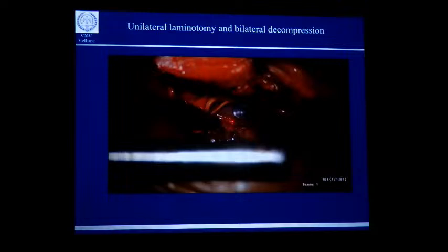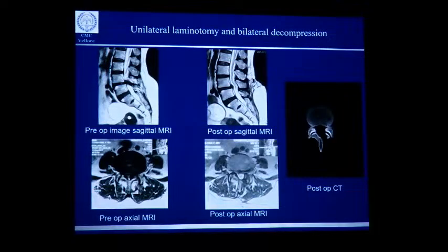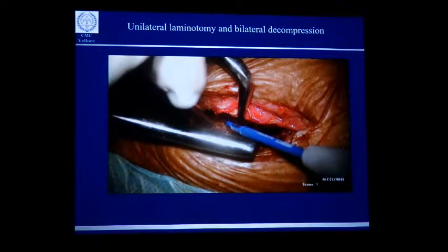So you can see this is the spinous process, this is the lateral border, this is the medial border, this is the cranial side, and this is the caudal side. And you've used a drill to decompress the bone.